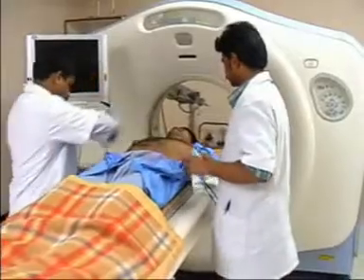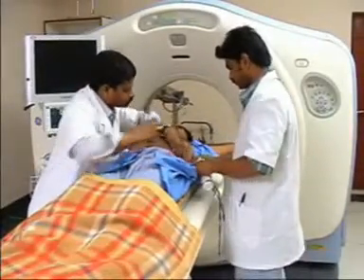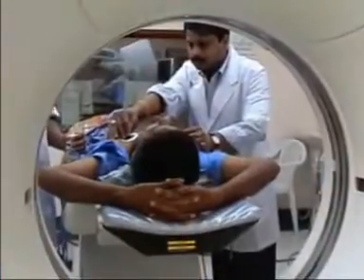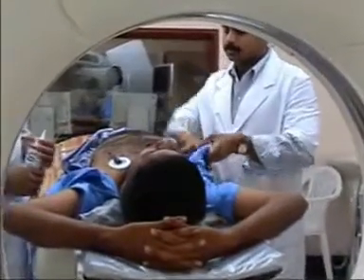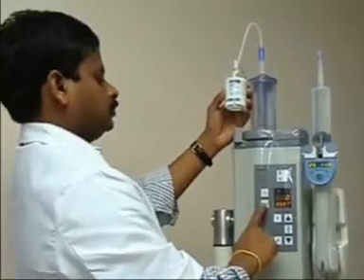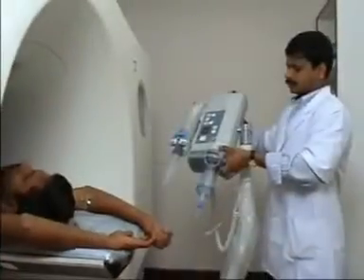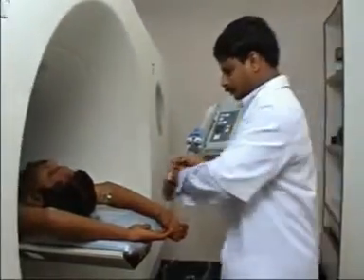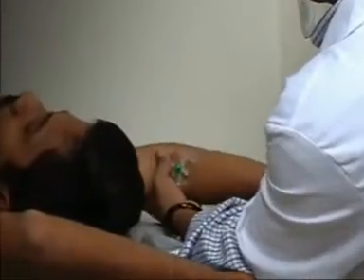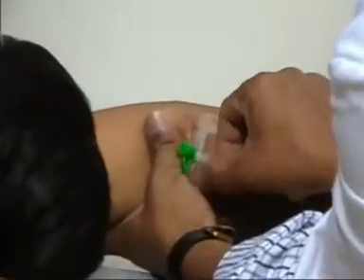The ECG leads are connected after the patient is positioned on the CT scan table. The patient is ready for the scan. The contrast material is injected through a vein in the forearm.